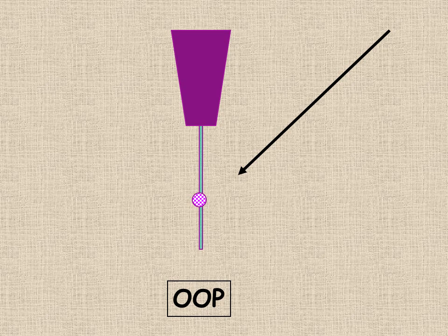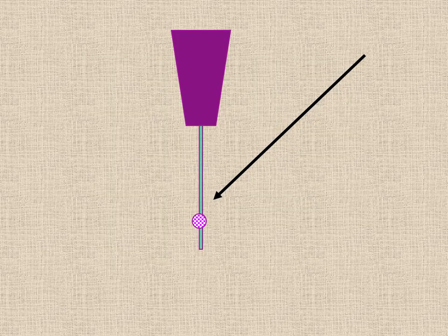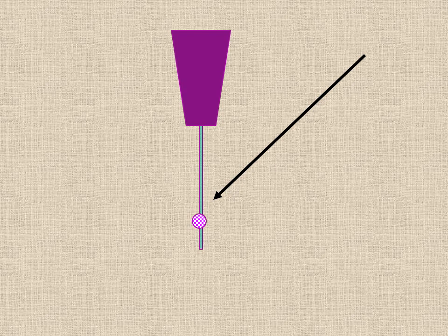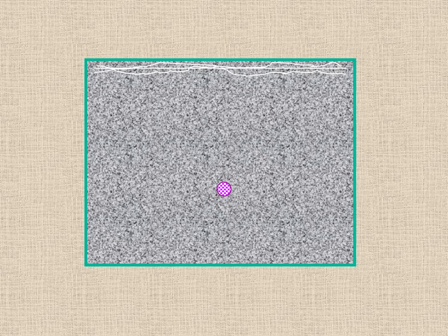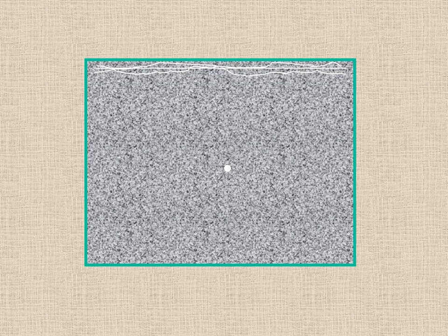If the needle is approaching out of plane, so here we have an ultrasound picture of the nerve. If we angle our beam up towards the shaft of the needle, we can now see the needle, which appears as a white dot in the middle of the screen, but we've now lost sight of it.